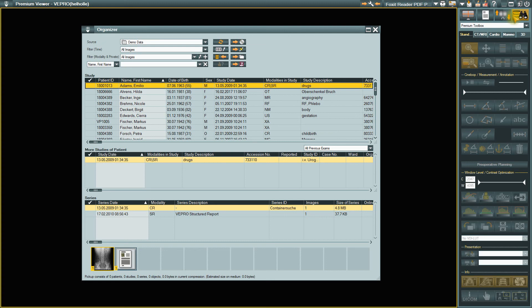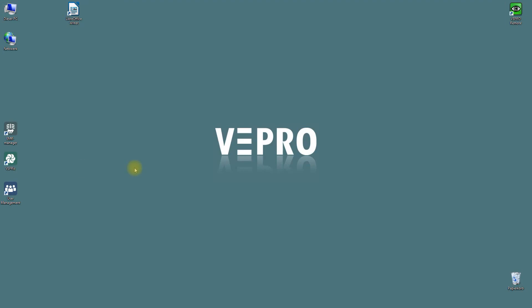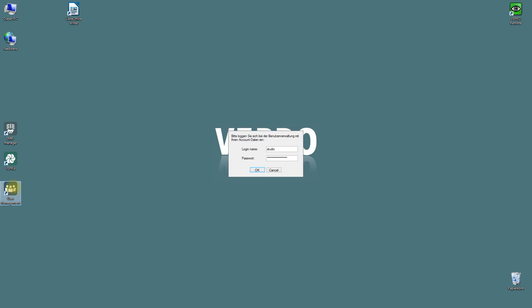If the EMR Manager is not available on your station, you can start User Management by double-clicking on the User Management desktop icon. Enter your user data here.